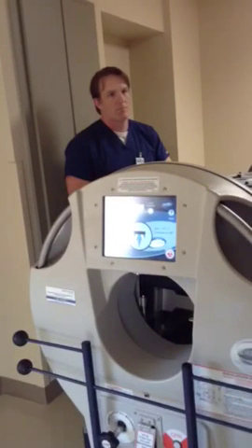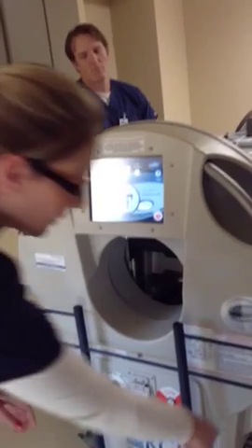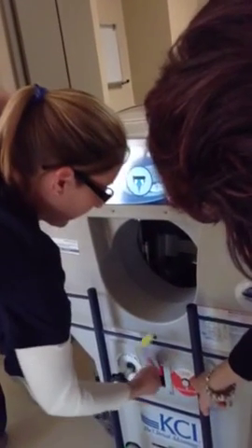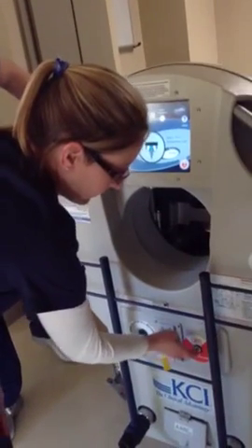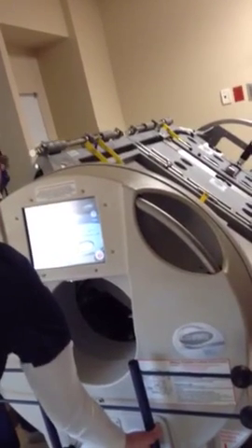Okay. So same thing. Bring the patient back again, back flat on their back, using that knob. Press and hold. No, this one right here. CPR. So the CPR button. We're just going to bring it back over a different way. Some way you haven't done it before. Typically, people use this.